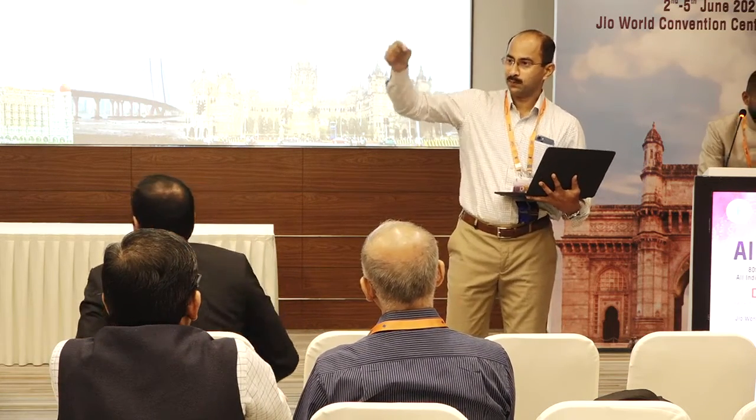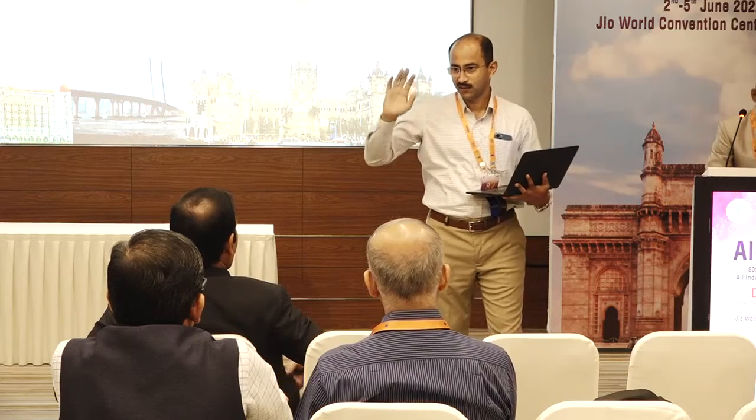I'll give you the history later. You have to have a machine and you have to have something clear. The point is don't depend on the machine. Yeah, the machine can fool you, so use your clinical judgment.